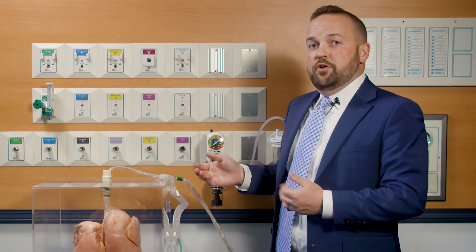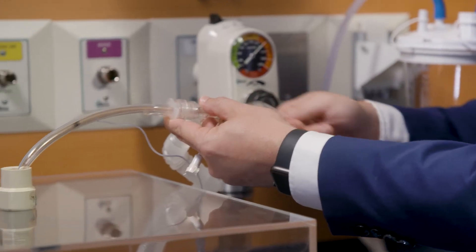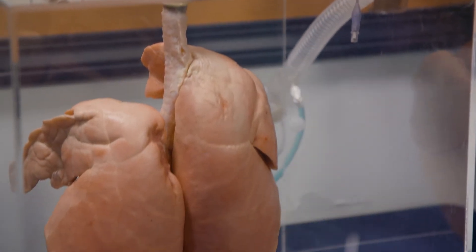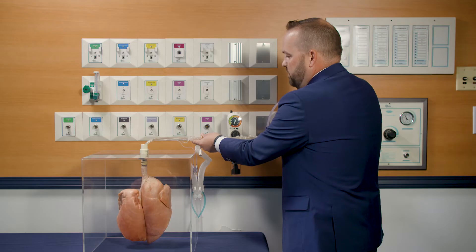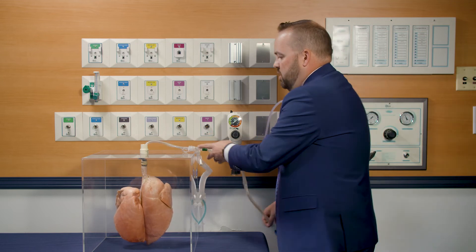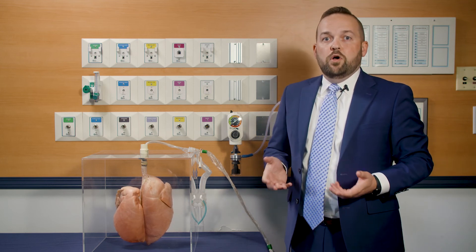Now that I've demonstrated the Push-to-Set procedure with pressure set to 140, we're going to demonstrate what that looks like when we suction the pig lungs. As I advance the catheter, on the next breath you'll notice there's still a small amount of volume loss, but as I withdraw the catheter the ventilator is able to recuperate much more quickly, with far less volume loss than with full wall suction pressure.